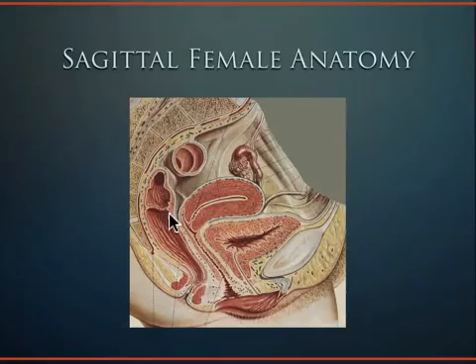And in women of childbearing age, every month one of the ovaries ovulates and pops out an egg. And as that egg is growing in its follicle, about to ovulate, as the follicle's growing, I should say, fluid is inside that follicle. The egg pops out, the fluid rests in the pelvis in a dependent location, which is the posterior cul-de-sac or pouch of Douglas. So it's normal in the female pelvis to see some anechoic fluid kind of rolling around back here in women of childbearing age. It's always abnormal, though, to see that in a male pelvis.